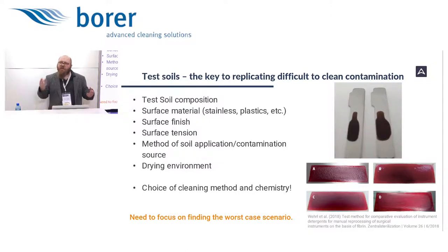So you have to find logic in application of process challenge devices. It was a fantastic article because it shows you the steps and shows you also how very different the nature of proteins on surfaces is, because this is something that causes nightmares to us in the laboratory when you test different types of proteins processed in a different way. And I tell you one more thing. Because we are talking about proteins, we are talking about the physical and chemical properties.